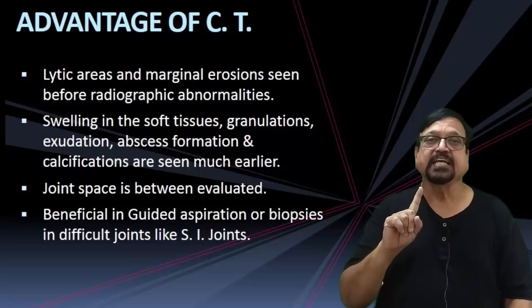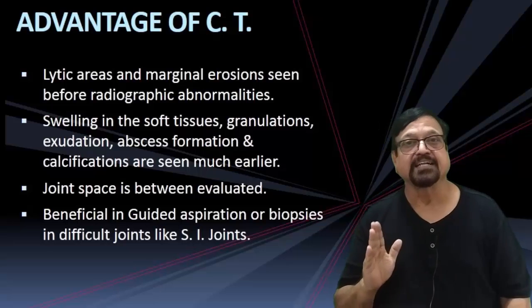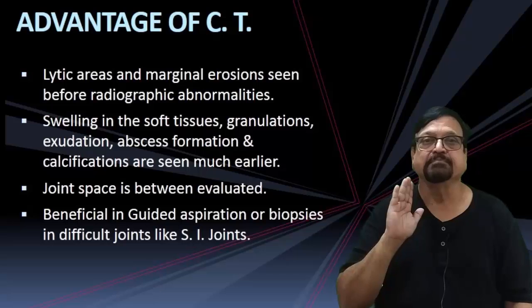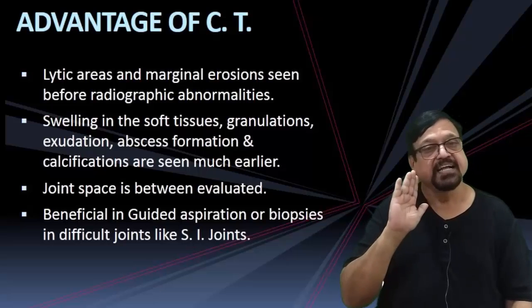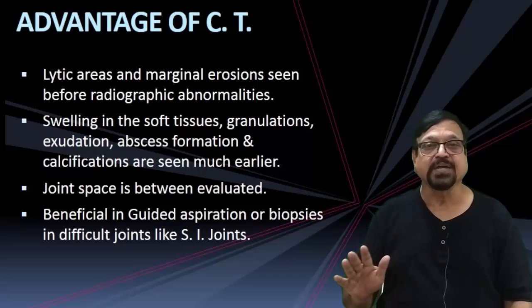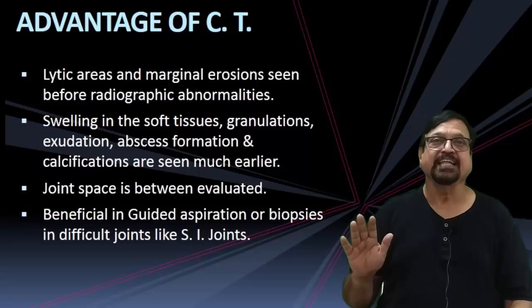The joint space is evaluated better. CT is also beneficial in guided biopsies, because SI joints are really difficult to get at with anything other than a CT scan.